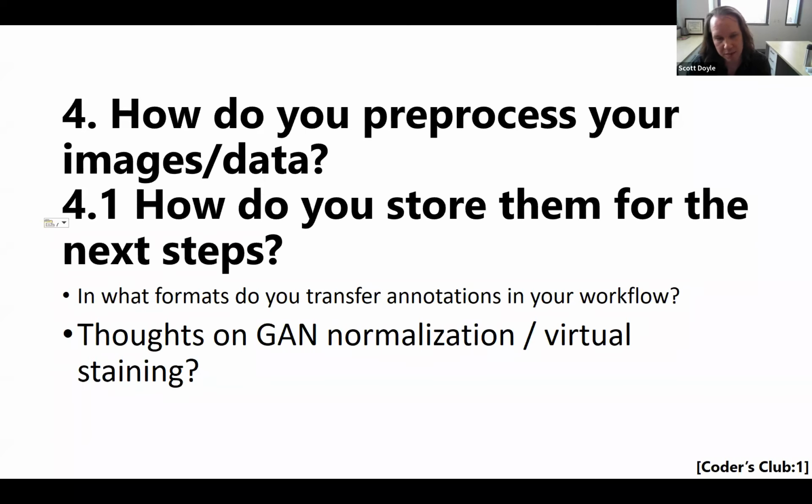If you don't have the option, is it better? We'll do the experiment and we'll find out. But we did an experiment a couple of years ago with stain normalization, not GAN based, just regular stain normalization, and found that stain normalization does not eliminate batch effects. The only thing that eliminates it is training on data from different places. So getting more variability in your data set, not just variations on the same data set, at least for pathology, is really important, and I think it's tough to get around that. The GANs are not the solution to that.